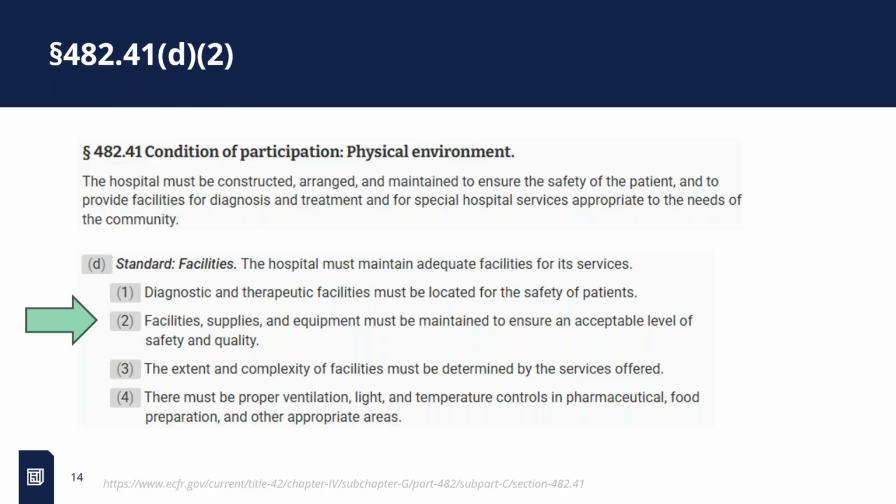There's still a little bit of separation in the DNV world with the PE7 for medical equipment. A lot of that language in the DNV is a little bit more specific than what Joint Commission is now. I don't know if they're going to get less specific either. I don't know if there's a push from CMS, the Center for Medicare and Medicaid, to do that or not. I know that's where the push came from for the Joint Commission, but this is what ultimately we're adhering to.